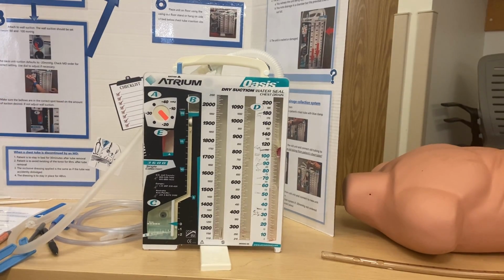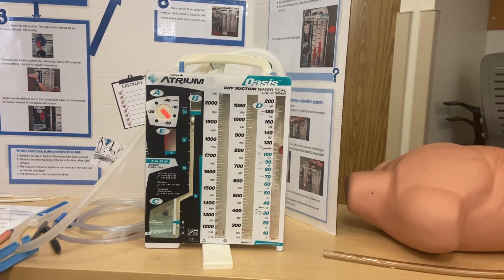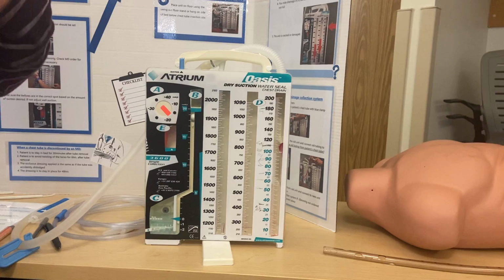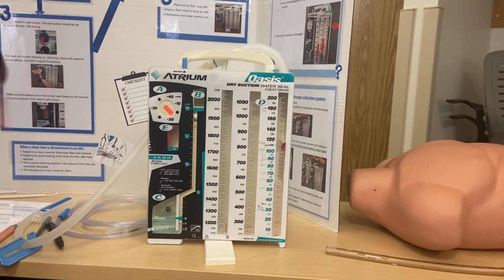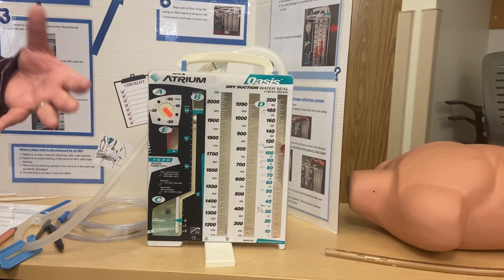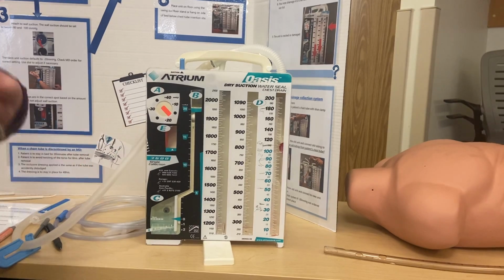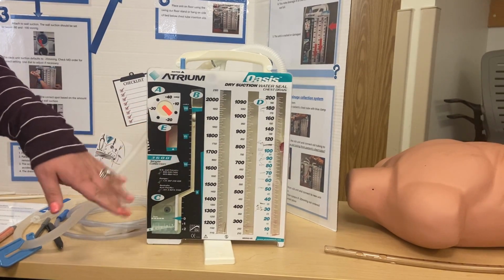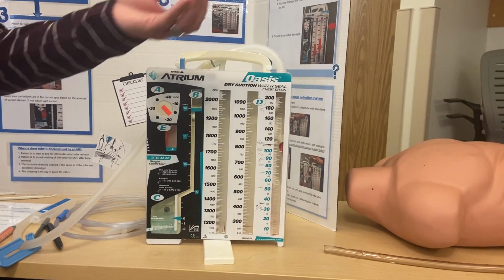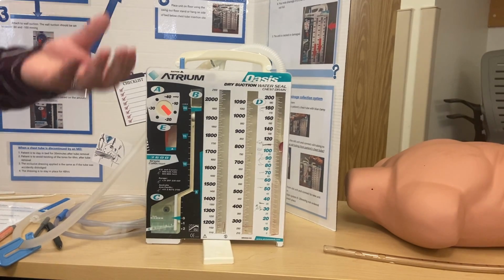Lastly, we also have a suction area. That's the internal suction, because even though we have the chest tube and we have a water seal and we have a drainage area, we can't just rely on gravity. So we need to have a little internal suction. And when chest tubes were a 3-bottle system, this was the third part. And it was actually made of water. And that created some suction so that it would help with that negative pressure and help pull some of that blood or air or fluid out.